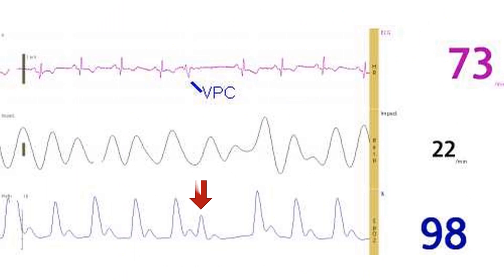The pulse oximetry tracing of ventricular premature complex shows a lower amplitude corresponding to a lower pulse wave amplitude for a premature beat.